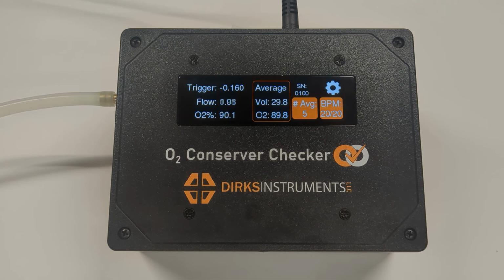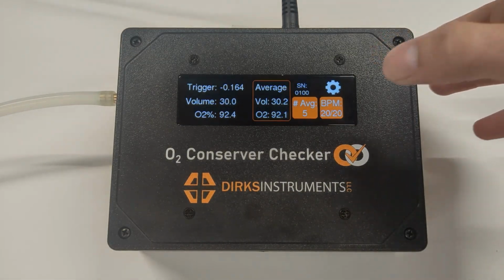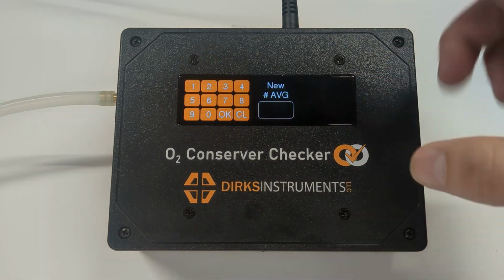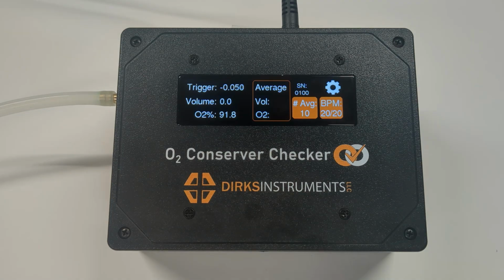In the middle of the screen, we have the average values for volume and oxygen concentration. You can change the number of points to average by clicking the average box and then setting that number. The number of points to average can be set from 1 to 20. These values will only update for pulse settings and will not update during continuous flow.